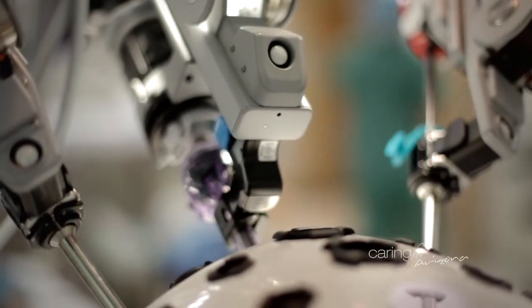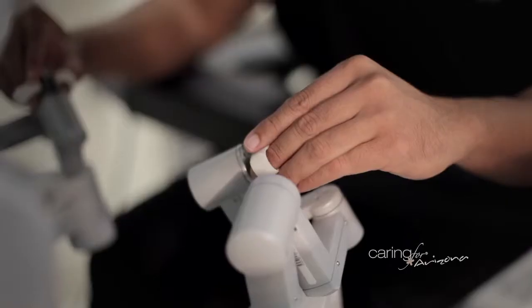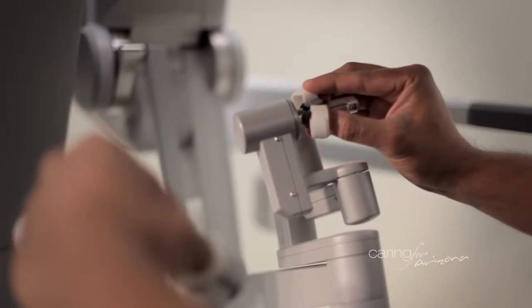And then I step away from there and then step inside the working console of the robot, which is in the same operating room, but is 3-4 feet away. I'm still in control the whole time. I'm still in control of the procedure. I'm still in control of the patient. However, I use the console for the working arms and the movement inside.